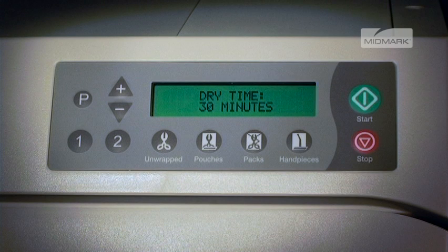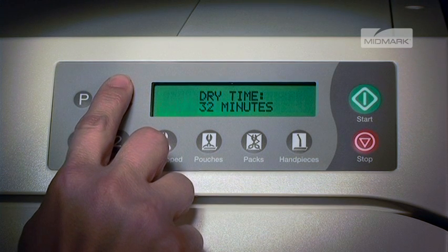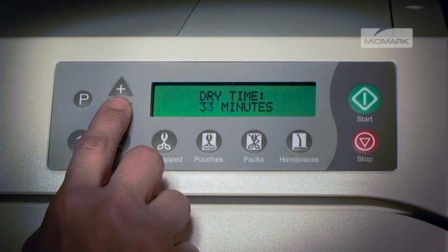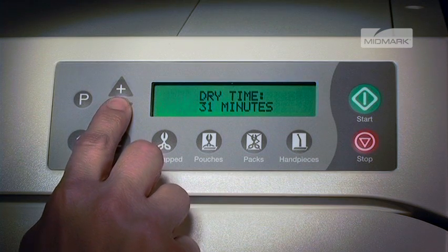The display shows drying time and the current number of minutes. By pushing the plus or minus button, the drying time can be changed in 1 minute increments. Dry time can be set from 0 to 60 minutes. Once the desired drying time is displayed, press the P button to store the program.